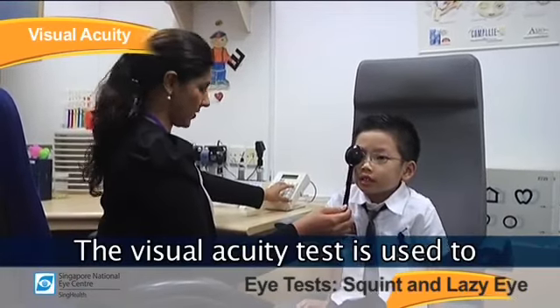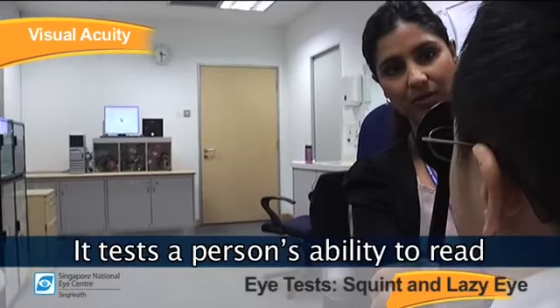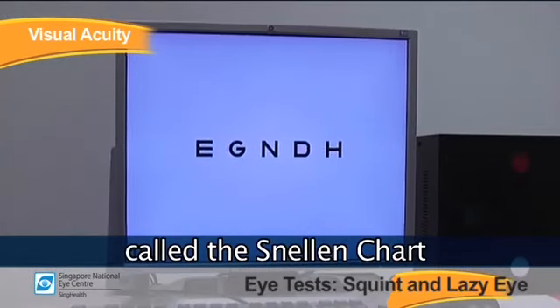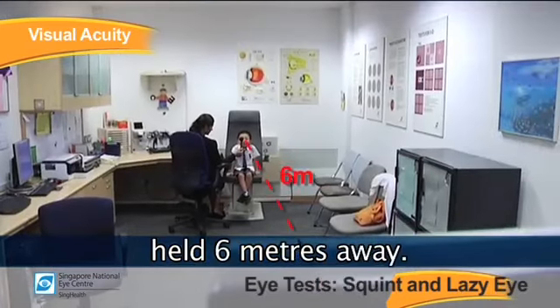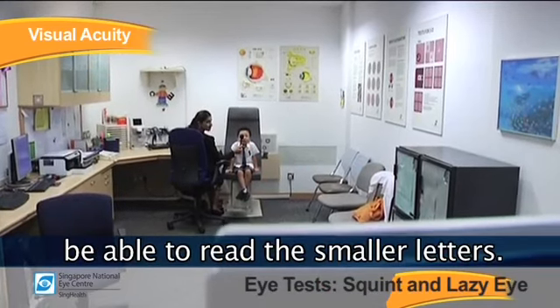The visual acuity test is used to determine how well a person can see. It tests a person's ability to read the smallest letters on a standard chart called the Snellen chart, held 6 meters away. People with poor vision will not be able to read the smaller letters.